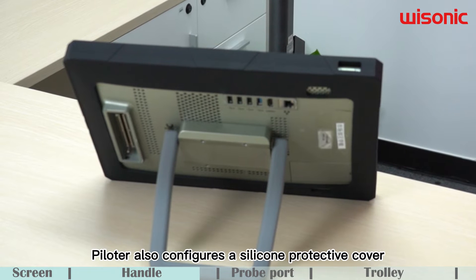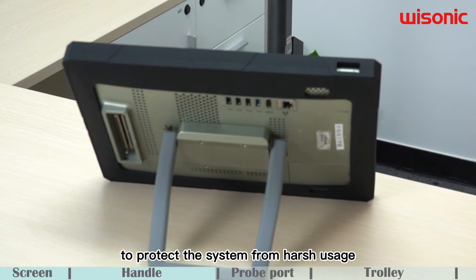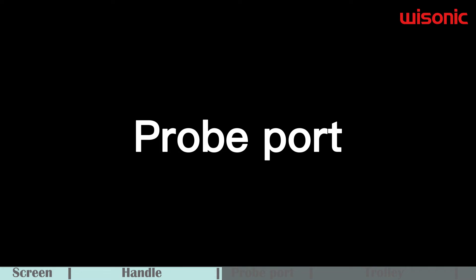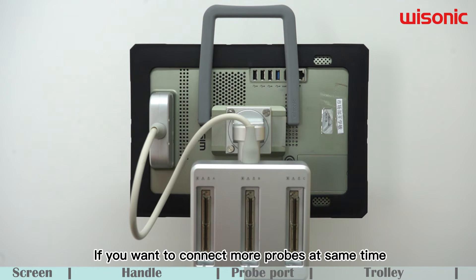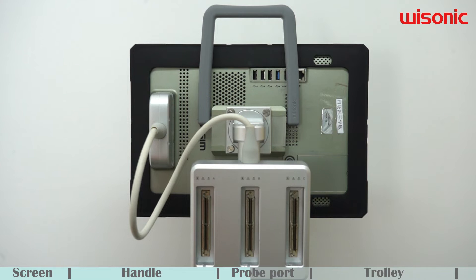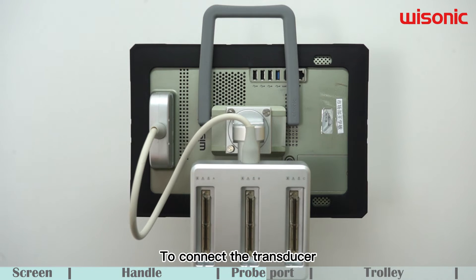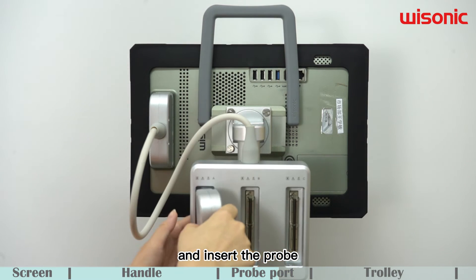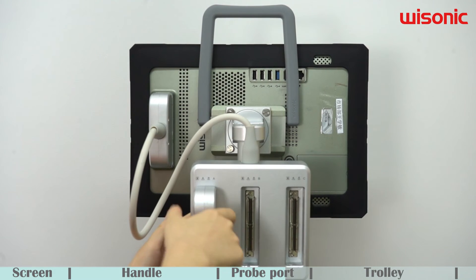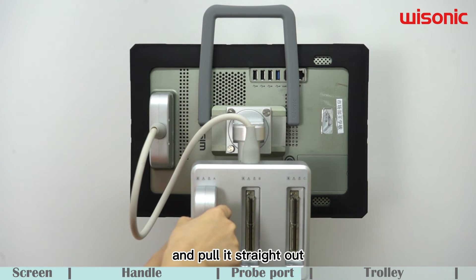Pyrozer also comes with a silicone protective cover to protect the system from harsh usage. There is one transducer port at the back of the machine. If you want to connect more probes at the same time, please connect the 3-in-1 probe adapter. To connect the transducer, slide the button and insert the probe. To remove the probe, slide the button and pull it straight out.